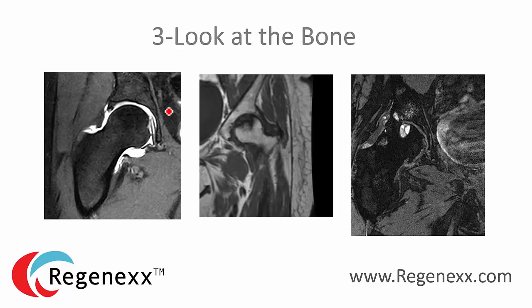Number three: look at the bone. In this area you want to make sure the bone is uniform in color — in this case it's uniformly dark, so that's good. In this next case, the normal bone is white, but this dark area means dead bone, so you're looking for a change in color. Here we have a patient with large cysts on the ball side and the socket side, which is another type of dead bone. Problems in the bone are an indicator of arthritis.